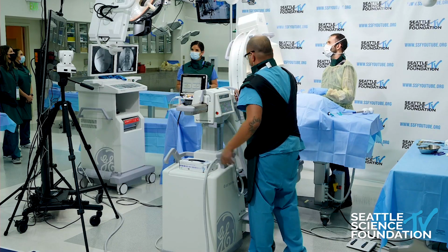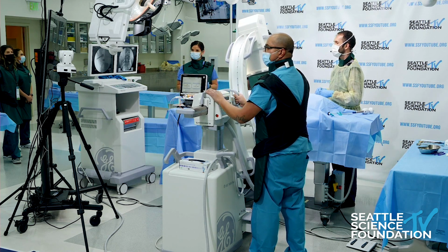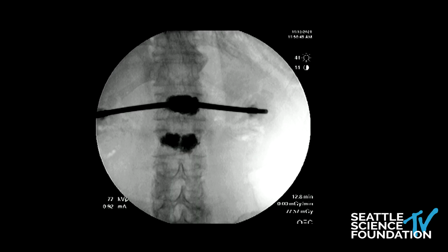Great job, Doug. Thank you. Really showed up well. If we get a look at that deployed spine jack, then we'll wrap it up and move to the next talk. That's beautiful. So on this one, we could take the camera to the tabletop here. That's perfect, just like that. I think we're over and out. Let's go ahead and take it out. I'll show the deployed spine jack. We can take a look at the patient.